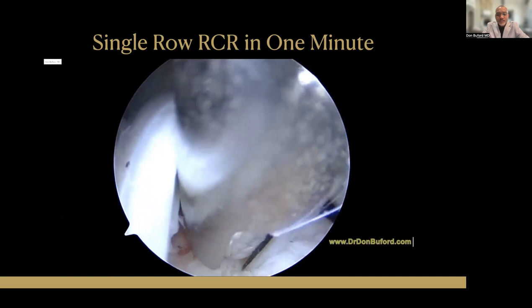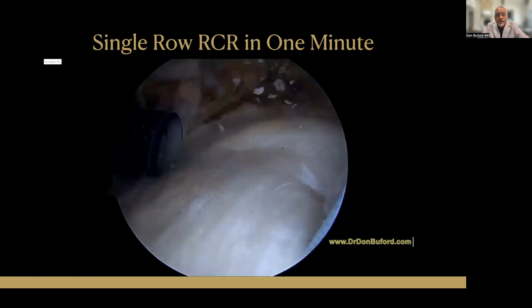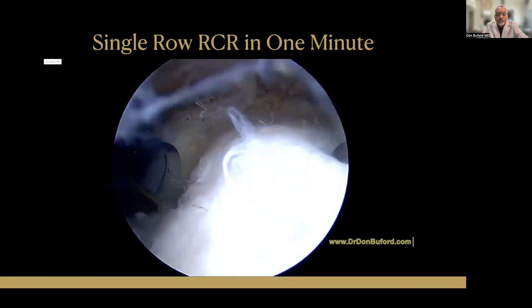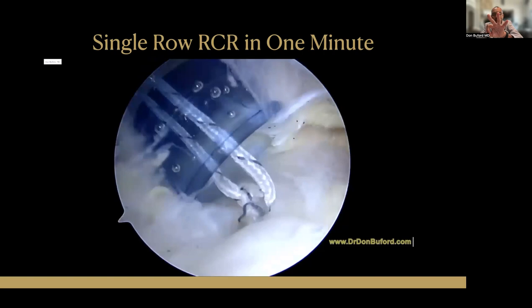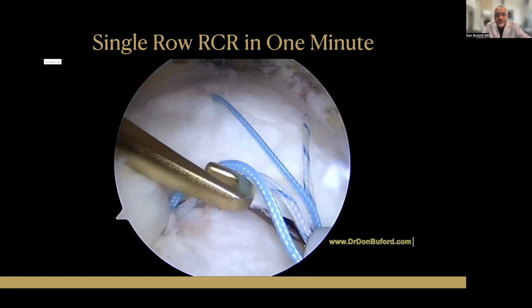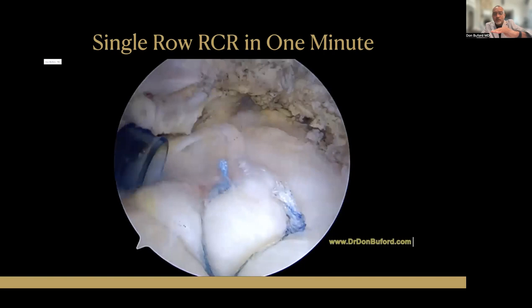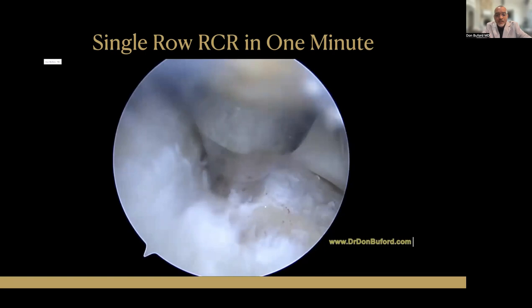Here's a surgical video of a right shoulder in the lateral decubitus position. You can see an all-suture triple-loaded anchor — the footprint taken up by that anchor is only about 2.8 millimeters, very small but very strong. The key is aligning those three sutures spread apart, which maximizes the grasp on the tendon and minimizes stress on each suture. After passing and tying the knots, we have a nice triple-loaded single-row rotator cuff repair close to the articular margin. The footprint will completely restore at about six months, and we use bone vents to allow marrow elements to come out for biological augmentation.